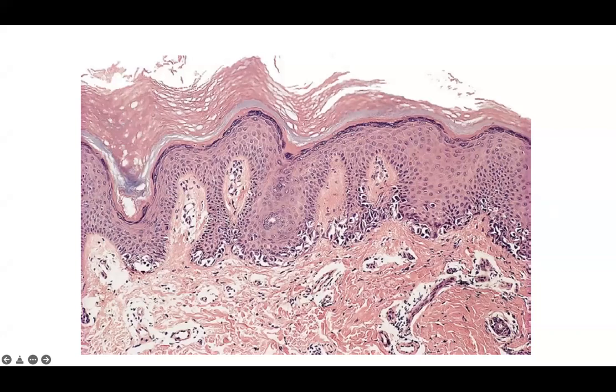Now, admittedly, this can be very tricky because you see that most of the melanocytes are down at the base of the rete ridge. So I often will do a PRAME stain on this, as well as maybe a P16 stain. Oftentimes, PRAME is diffusely expressed in acral melanoma. P16 is sometimes lost in acral melanomas, but in a head-to-head, PRAME seems to be more helpful. Of course, you're going to want to look at all sections of the epidermis that you have. In this case, I'd probably even cut deeper sections just to make sure that there's no better representative example here.